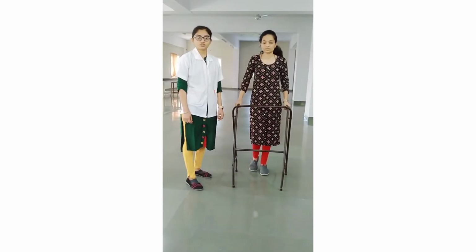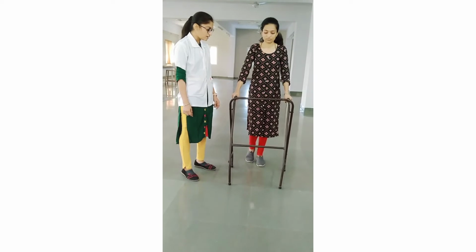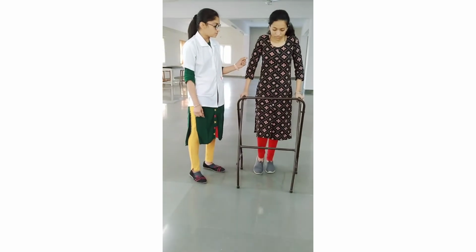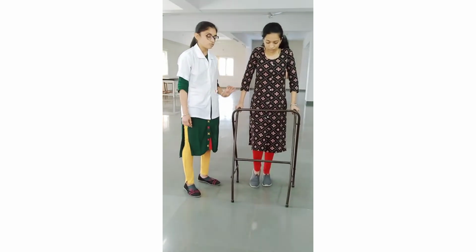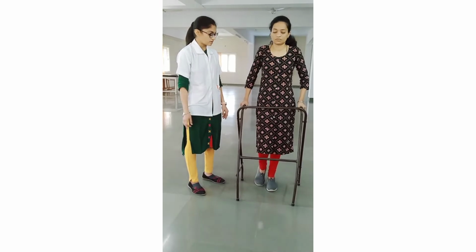Second is the partial weight bearing. Here the patient's right limb is affected. So move the walker forward up to the patient's arm length. Then the partial weight bearing limb moves forward. Here the weight is transmitted partially to the affected limb and partially through the upper arm to the walker. Then move the unaffected limb forward. This cycle is repeated.